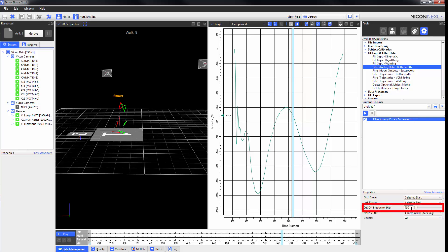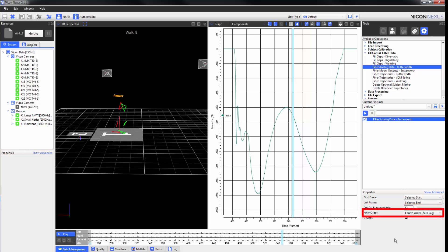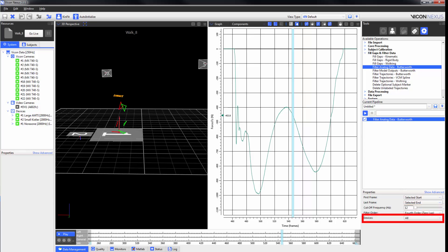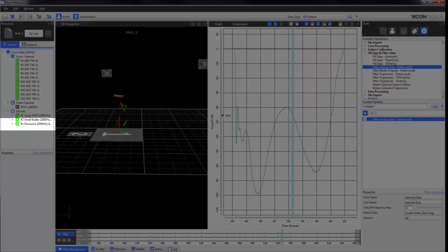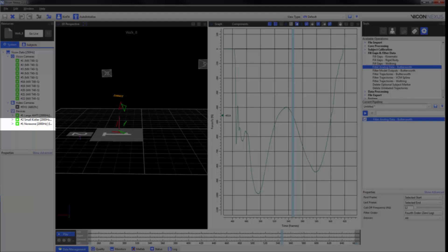And in this case, I'm going to select 12 hertz. We can also change the filter order from a fourth order zero lag filter to a second order that does introduce a lag. We can also choose which devices that we want to filter. In this example, I don't want to filter my Noraxon EMG.